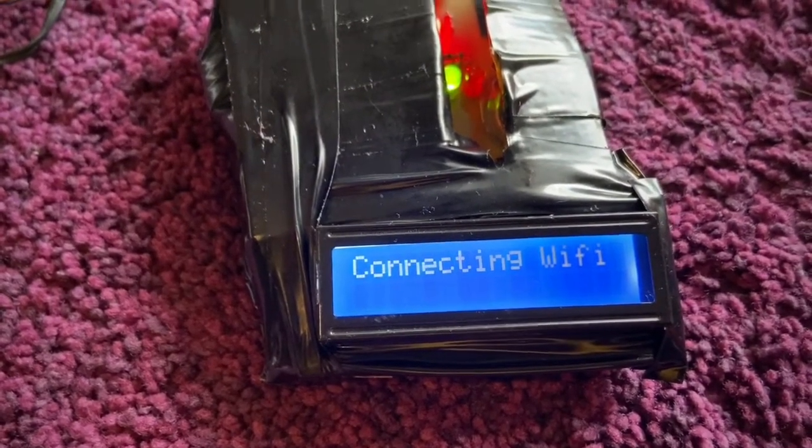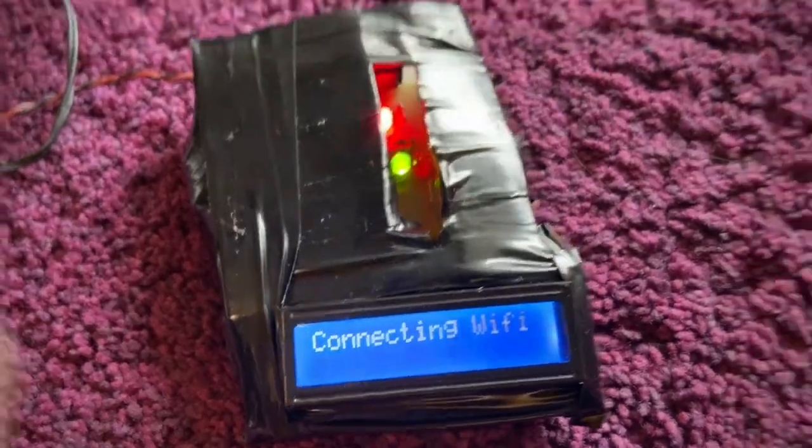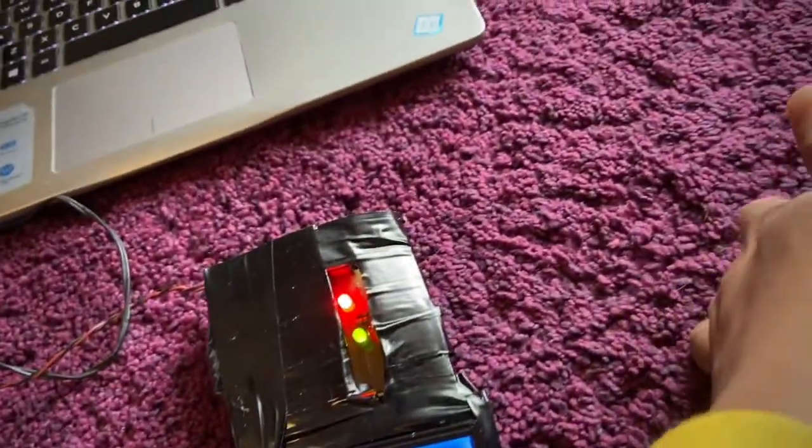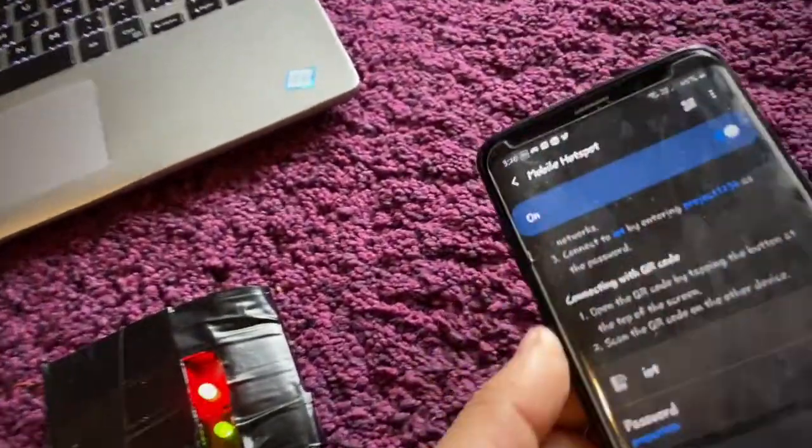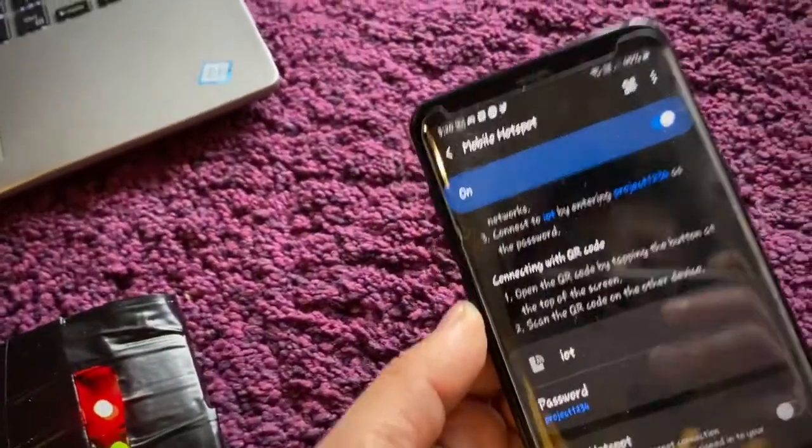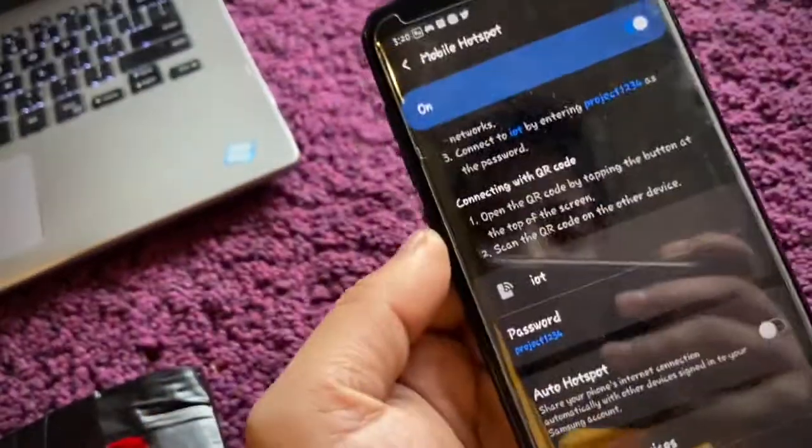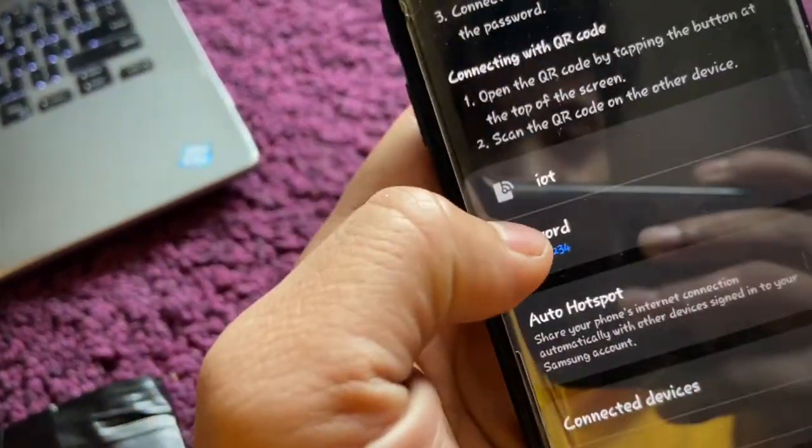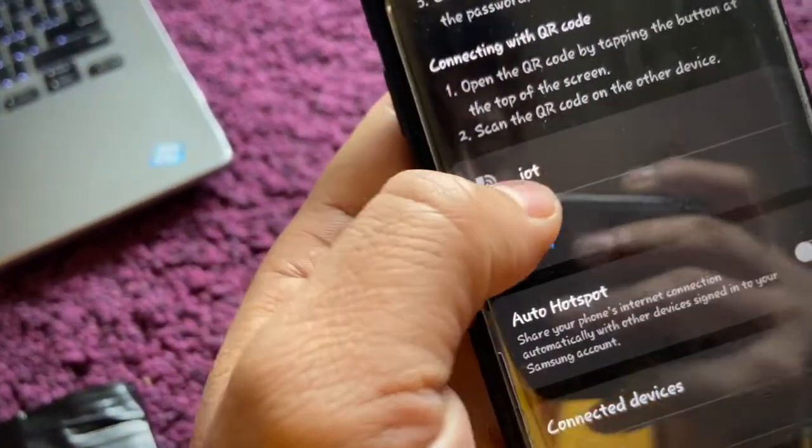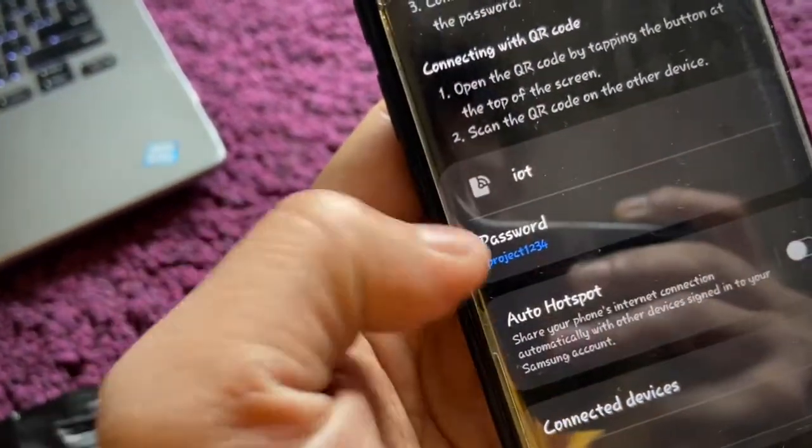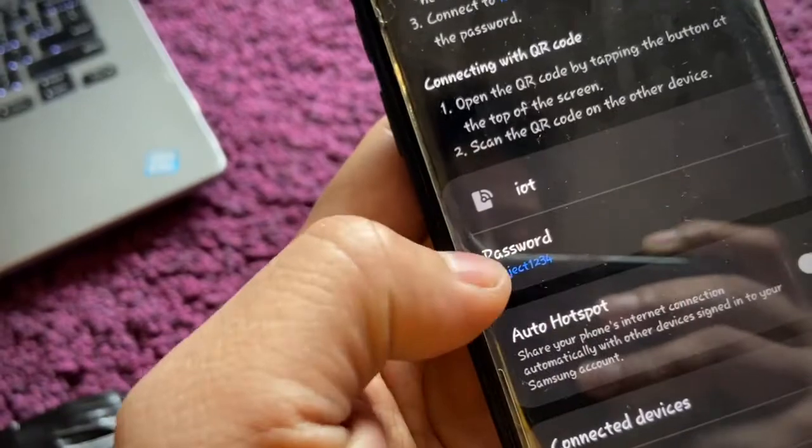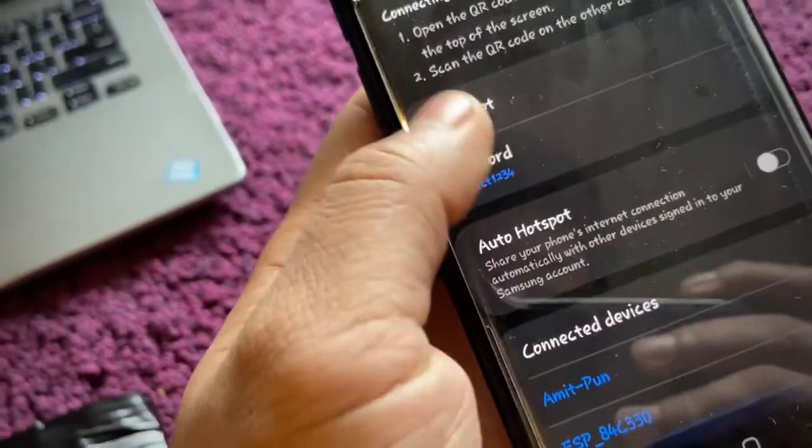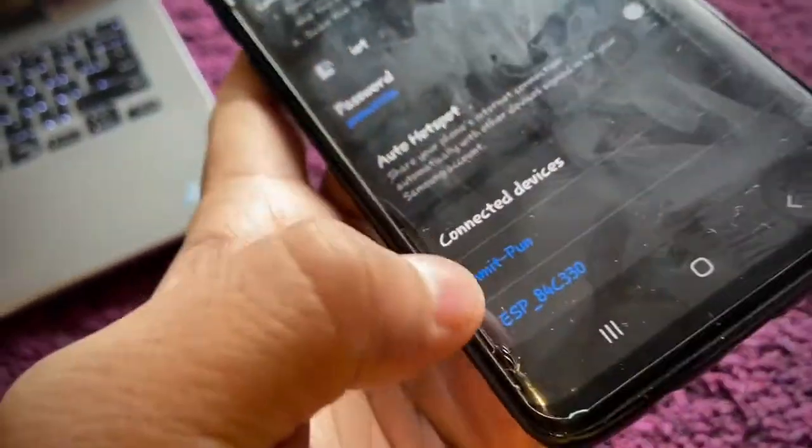It's connecting to Wi-Fi. I'm using my hotspot as an internet provider. You can see I have already set up the IoT and the password is here.